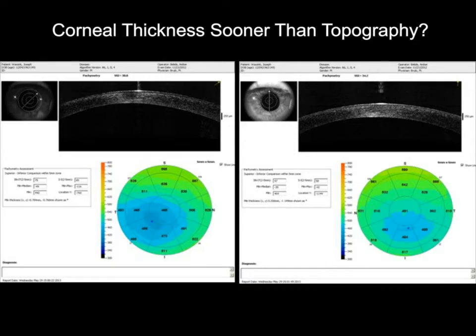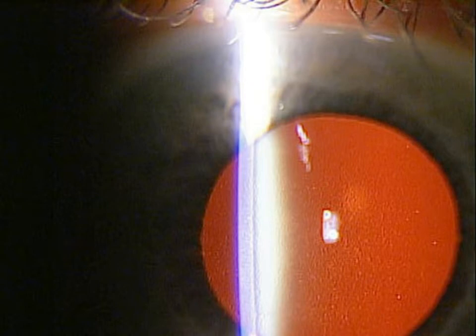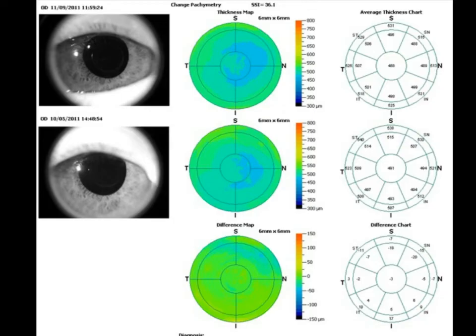What are we also doing? We're managing our patients with Fuchs endothelial dystrophy differently. If you think about how we used to measure corneal thickness with an ultrasound pachymetry probe, you can understand the challenges that exist with these individuals, in particular if you're not perfectly perpendicular to the cornea. Because what will actually happen is, if you're measuring the corneal thickness on a slight angle, again, not perfectly perpendicular with the ultrasound probe, you'll actually overestimate the thickness because you're simply not going through the smallest or the shortest area of the cornea.